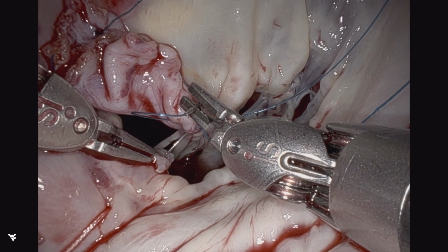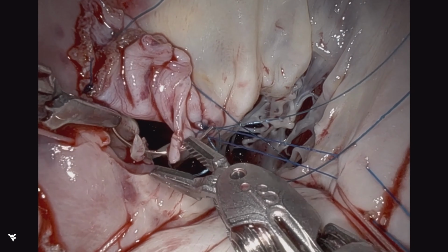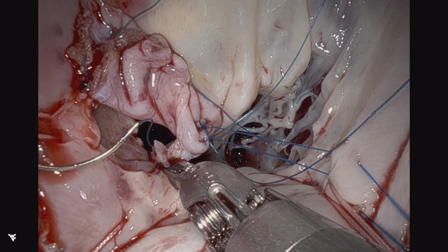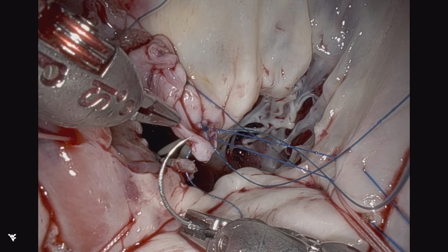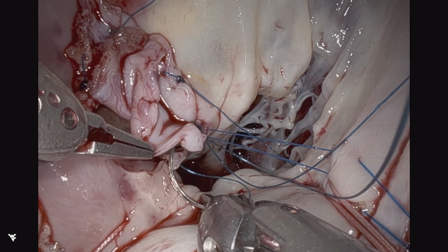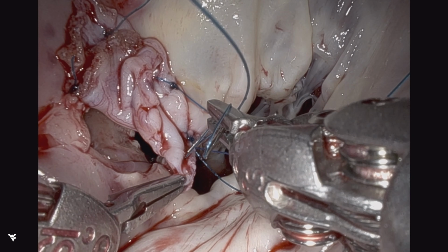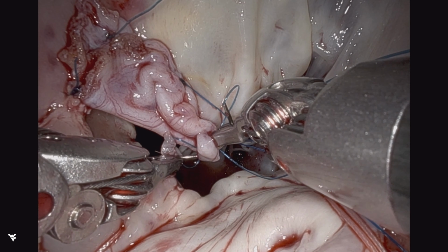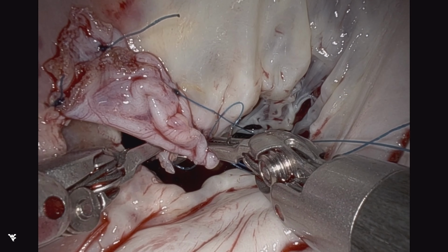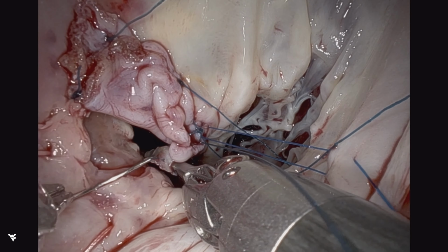So much like we have illustrated in previous videos in this series, we can utilize all of these techniques in our armamentarium now to rebuild the leading edge by reimplanting this secondary fan cord to support this patch. And you can see this is implanted in the leading edge.